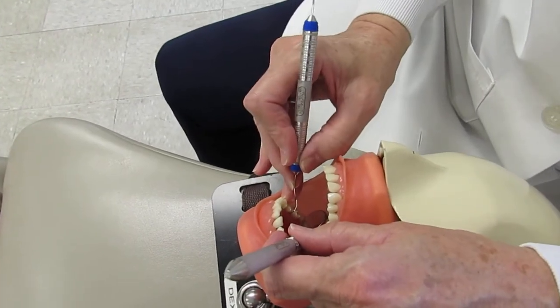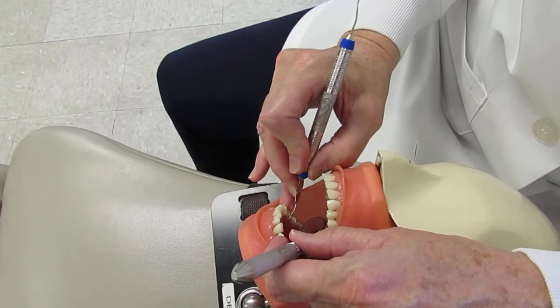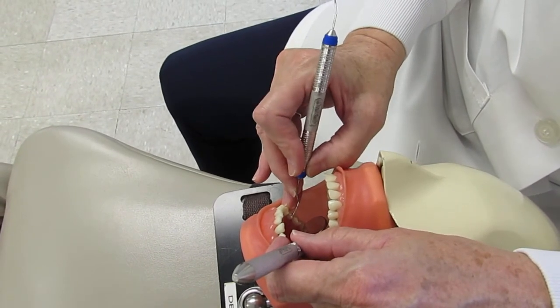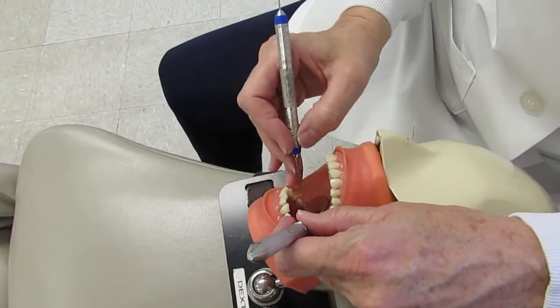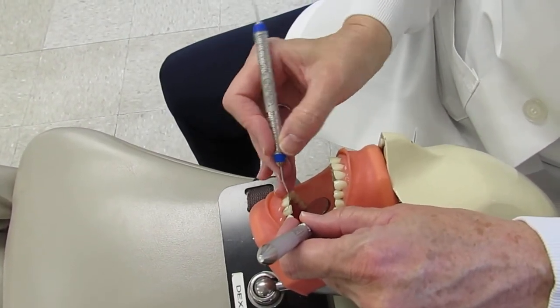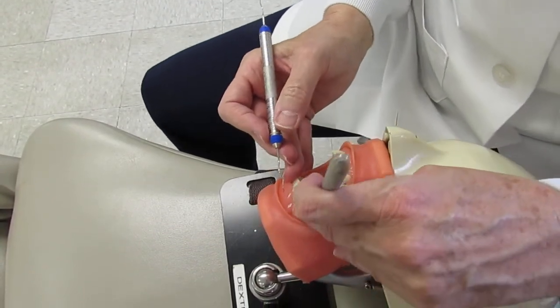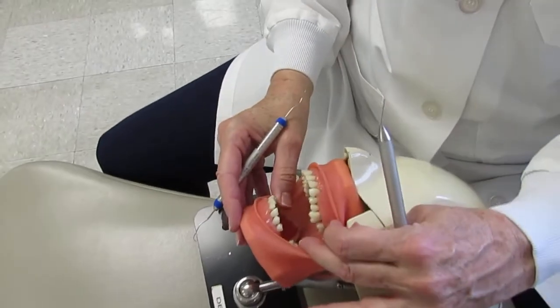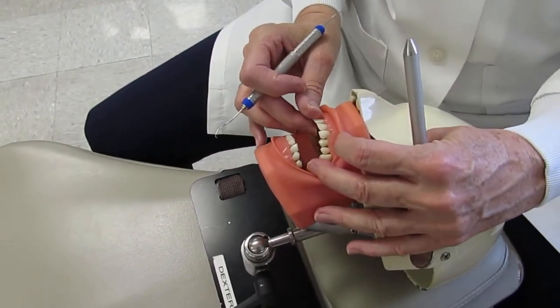Repeat that for teeth 29 and 28. Remember it's a light grasp. Sometimes strokes are multi-directional — horizontal, then oblique, then vertical. The anterior sextants haven't been covered yet, so there will be a pause before demonstrating those.